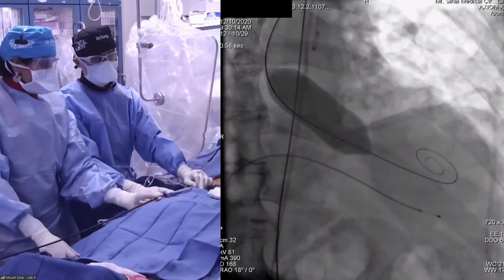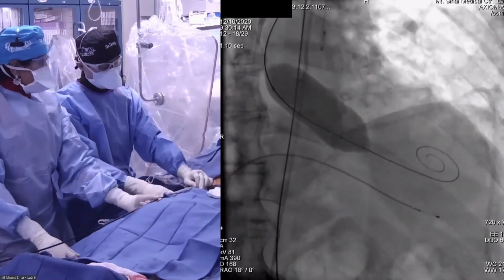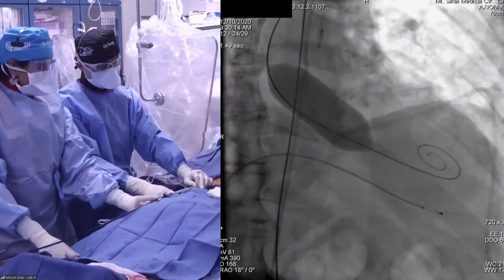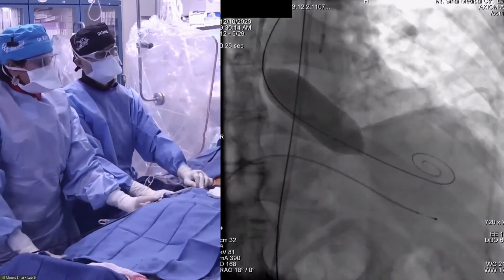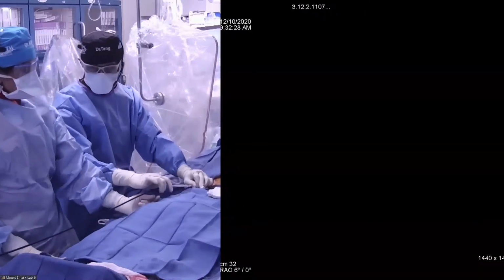We just wanted to make sure two people always confirm the skirt is facing down. We have Gilbert Tang, who is going to be the first operator. I'm going to be the second operator, and the wire will be held by Parasuram, who will be the third operator. Very important, all the three operators know what their job is, and we're just going to go up. You ready? Yeah. Starting.